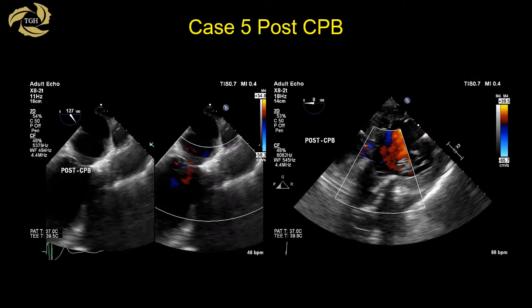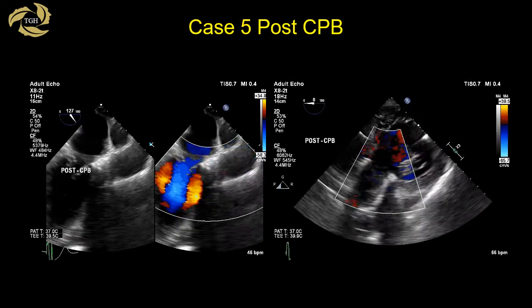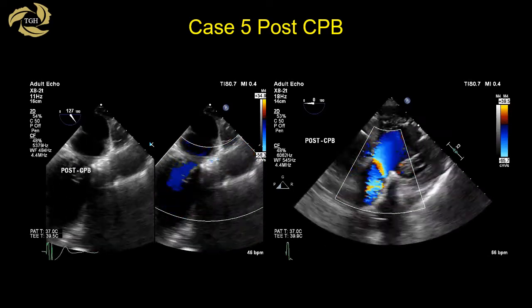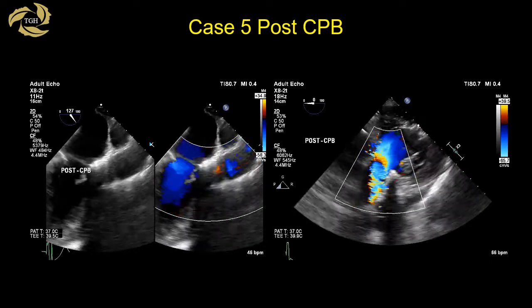Upon inspection of the valve by the surgeon, large fenestrations were found, making the valve unsuitable for repair. A 25 Hancock bioprosthesis was implanted with good effect.